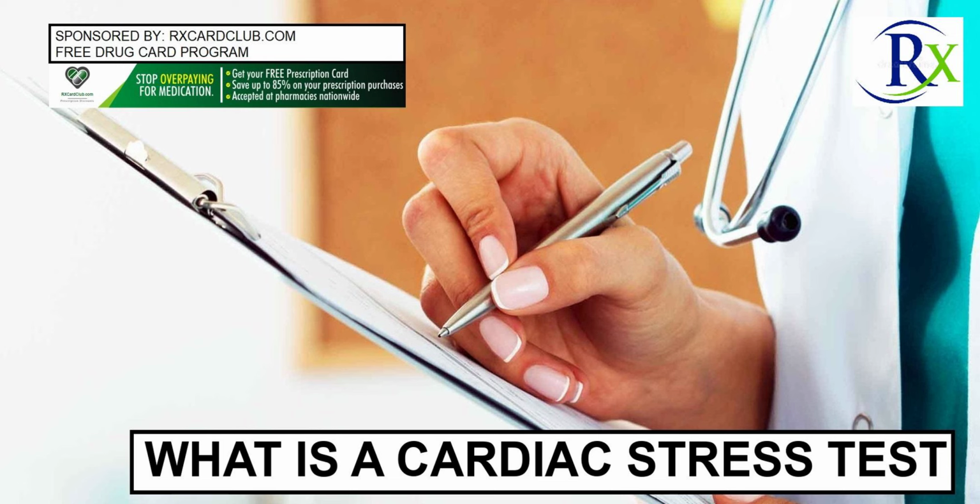At each 3-minute interval, your pulse, blood pressure, blood oxygen, and ECG are recorded along with any symptoms you may be experiencing. Do not grab tightly onto the handrails or handlebars as this may affect the results. During the test, you may breathe heavily, sweat, and feel your heart racing, but should not feel any overt pain or distress. If you do, tell the technician. Your ECG will be monitored throughout the procedure so that the technician can see if you are reaching your maximum heart rate, MHR, or approaching any real trouble.